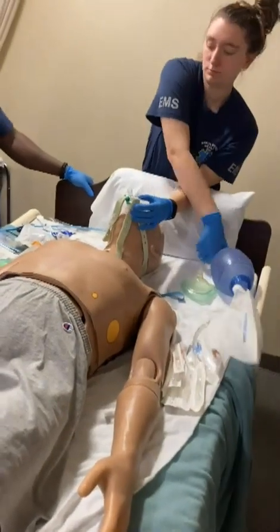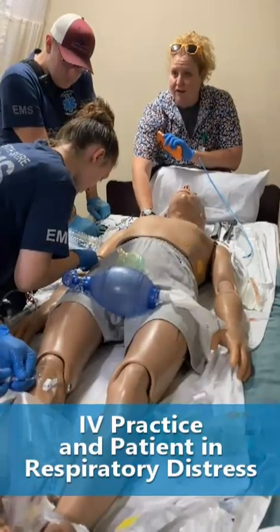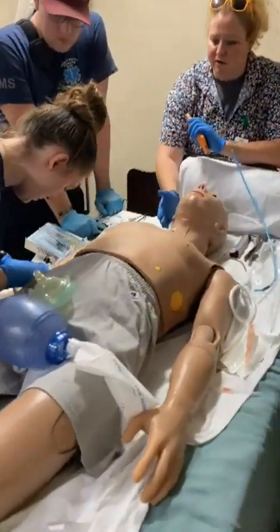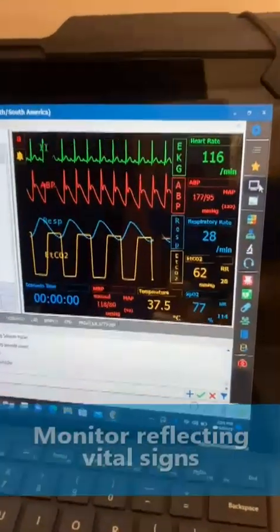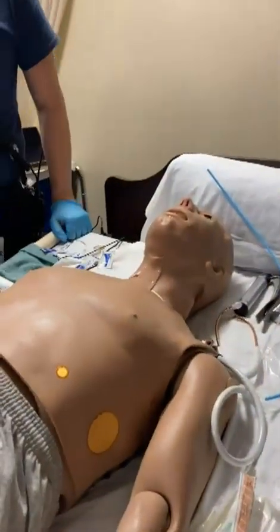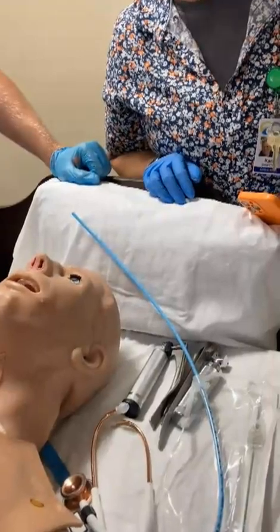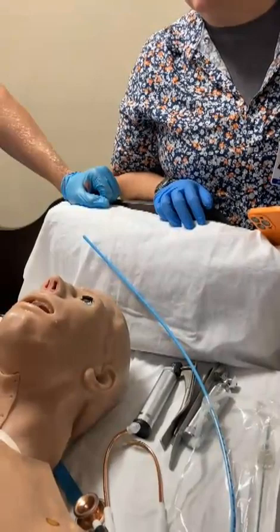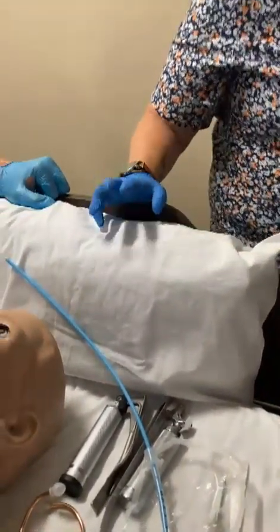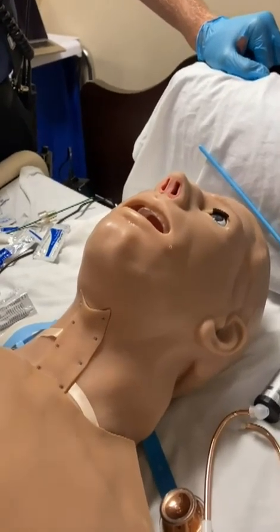Calen, she taught you — now I want you to teach us. He is at some point going to decompensate. Right now he's compensating with a high carotid pulse at 114 — we're feeling it. It's not just a monitor; we always want to read the monitor and our patient together. Josh is preparing for intubation. We have a respiratory rate of 28, which feels like it's matching. We're going to pretend the blood pressure is okay for now.